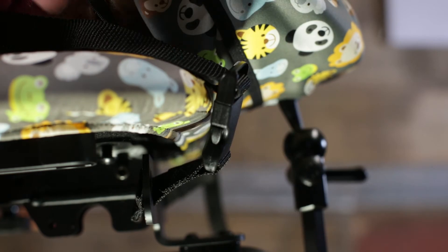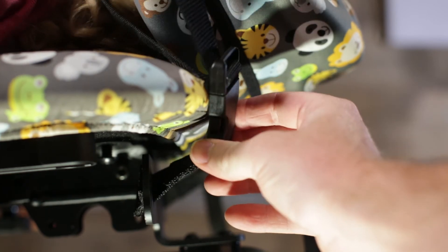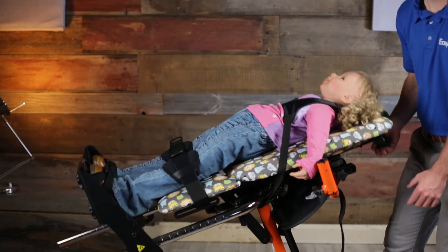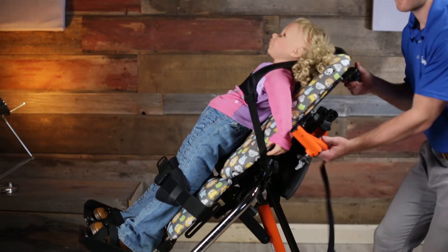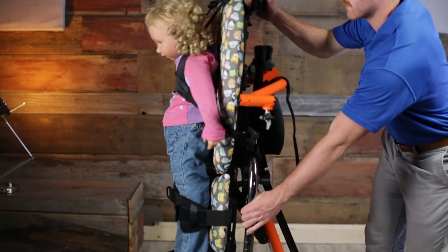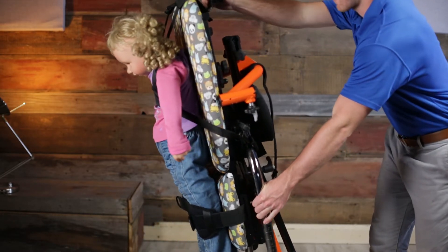This allows for more rehab time in the advantageous prone position. The non-stretch x-style chest vest also provides anterior trunk support in all orientations, as the Zing MPS and MPS TT can go from supine to upright to prone in one motion.